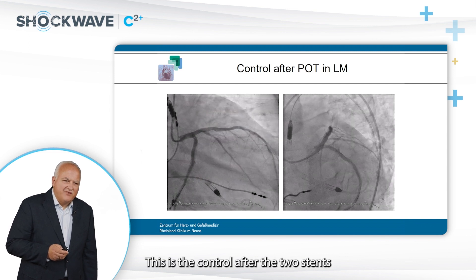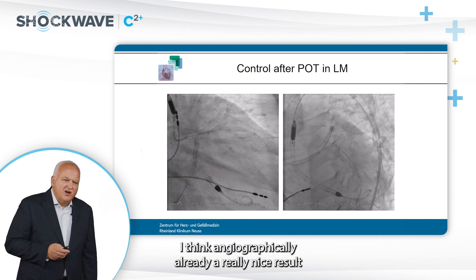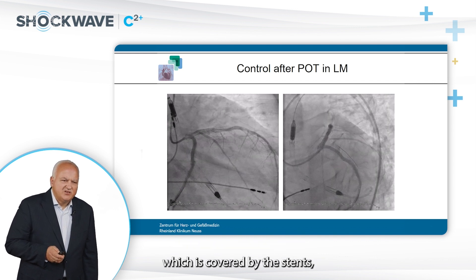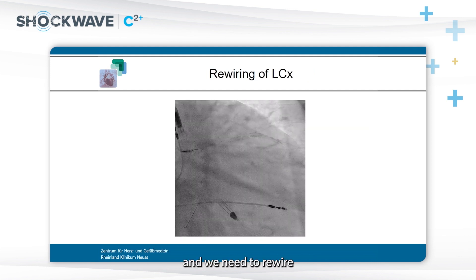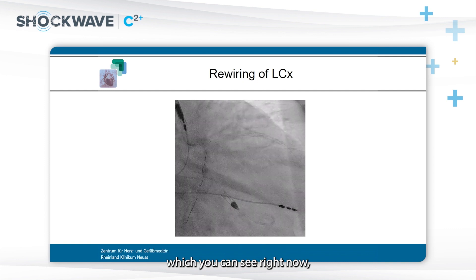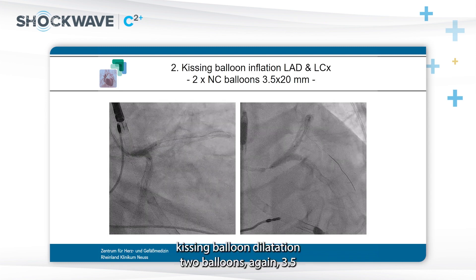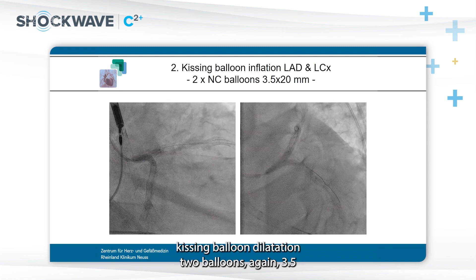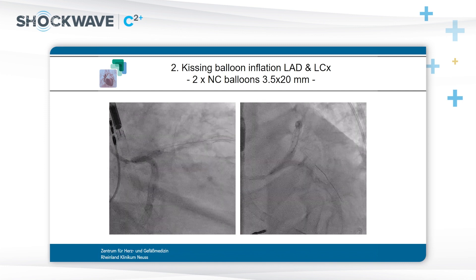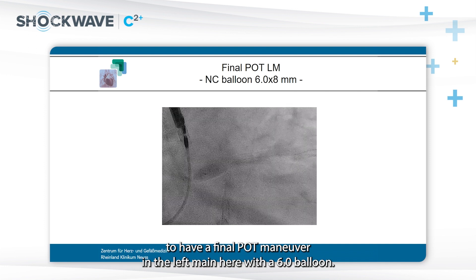This is the control after two stents and the POT maneuver in the left main — angiographically already a very nice result. The intermediate branch is still open despite being covered by the stents. We rewired through the struts into the circumflex artery, which was not difficult to achieve, followed by the second kissing balloon dilatation with two 3.5 mm balloons to open up the struts to the circumflex artery.